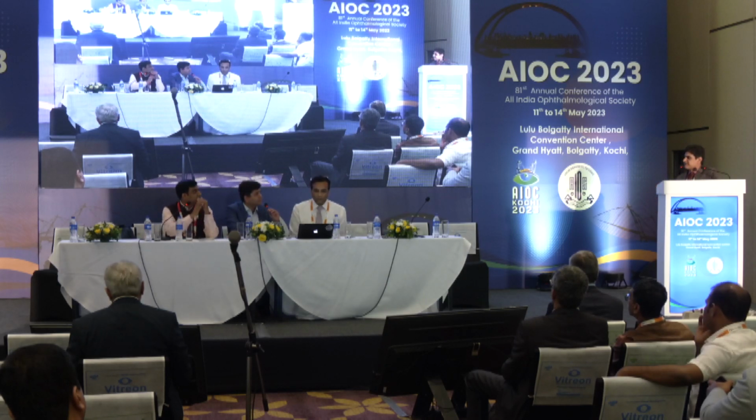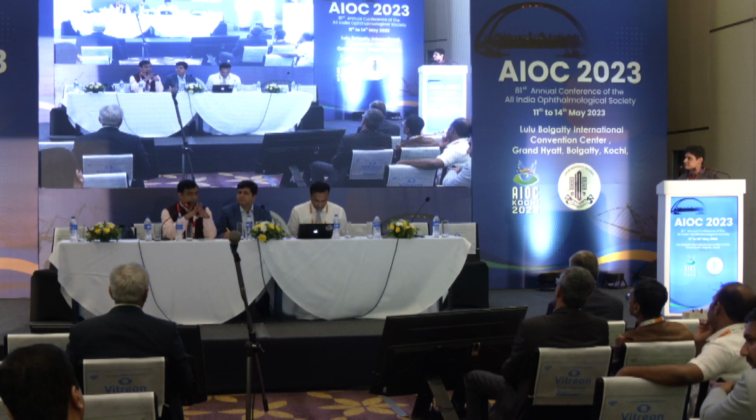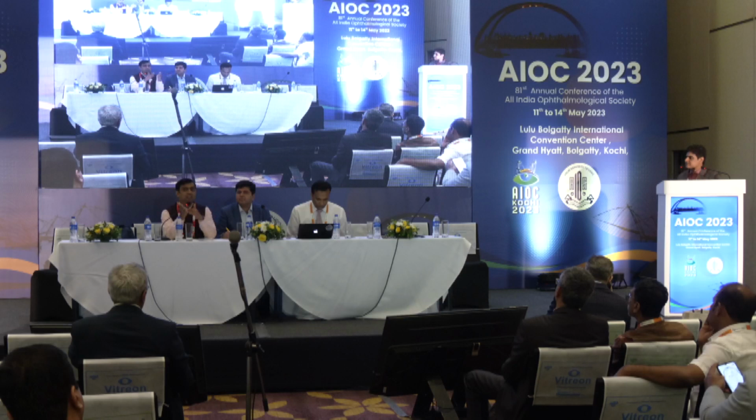In fact, I have done now around 12 cases, out of which 7 I have done with ILM peel and tried to do that. But the theory is there is a kind of little bit of negative suction, because when we put that ILM across, they usually don't come out, with just a gentle touch. And second thing is, I have even tried amniotic grafts also, and it sits quite good. In my 3 cases of amniotic graft, I have definitely seen a good improvement, and the fluid is coming down. Although I have seen 2-line visual improvement, not much more, we have not compared with vitrectomy with these kinds of ILM stuff or the amniotic membrane, whatever we are doing.